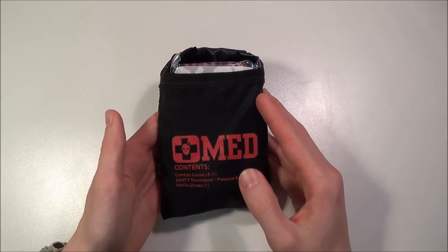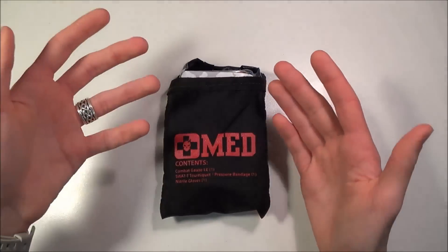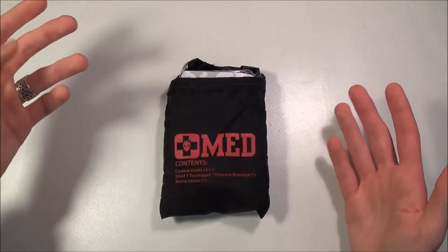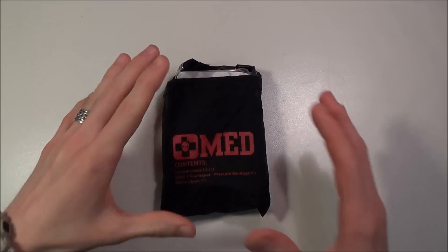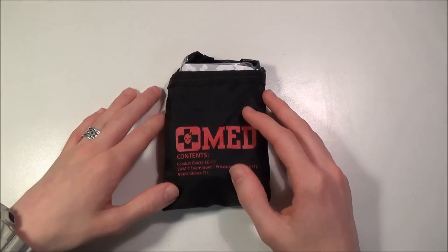One of the things I like to stress and look for in trauma kit pouches is how easy it is to access with one hand. A lot of the times, what you're going to get is an arm or hand injury. In the event of a severe arm or hand injury, you're going to be very limited — limited to only using one of your hands. So in my opinion, it's very important to think about your system and make sure it's easy to access one-handed.